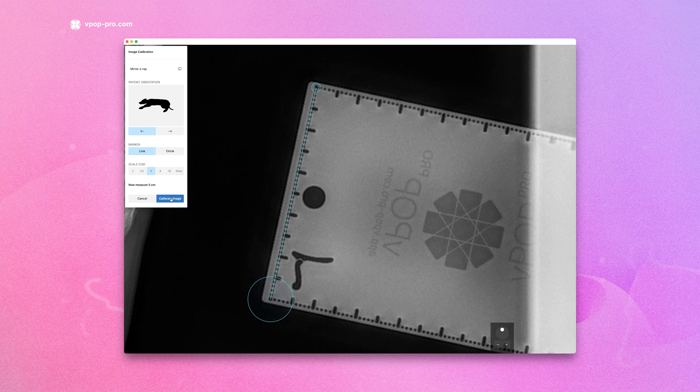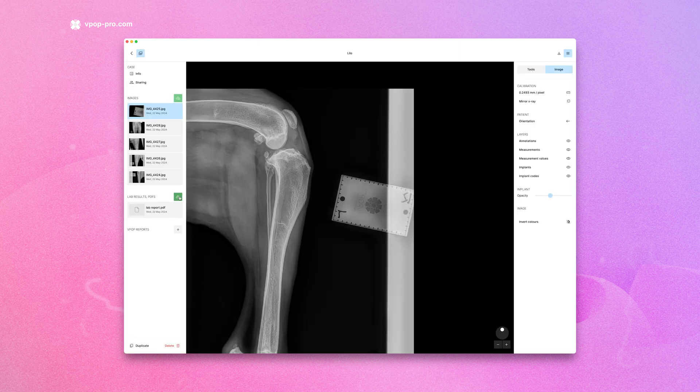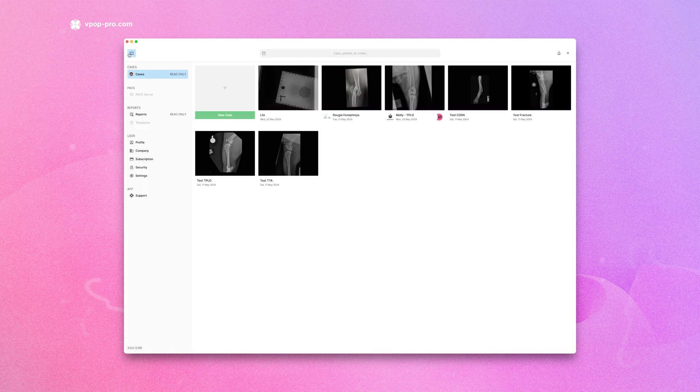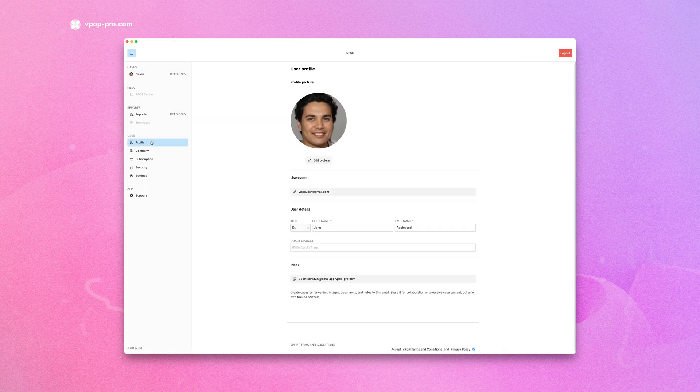Okay, VPOP saves all your changes automatically. Did you know you can also email cases directly to your VPOP inbox? This feature makes it easy to forward case emails to your VPOP account, especially when you're not at your desk.